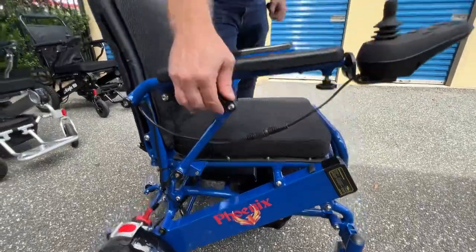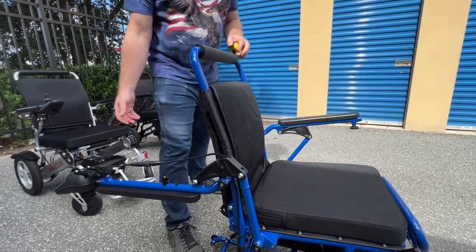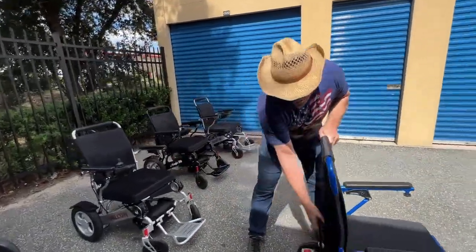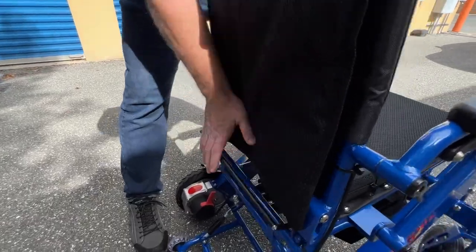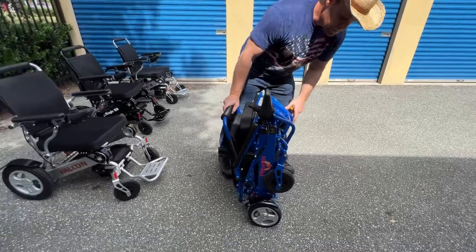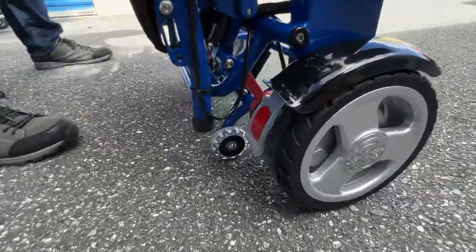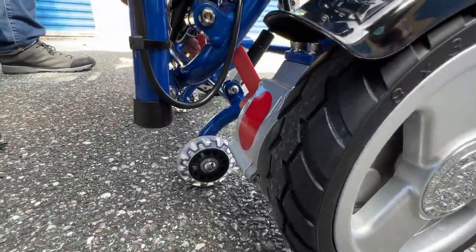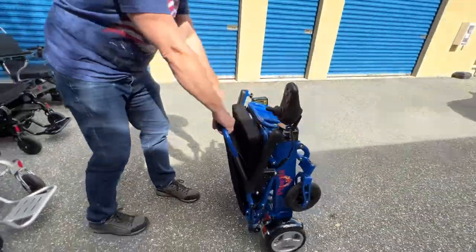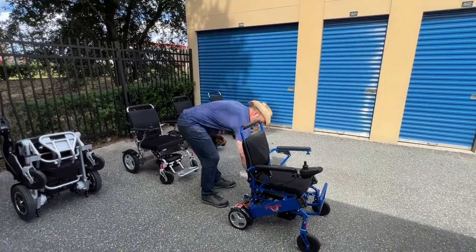The armrests on the Phoenix lift up and actually go totally behind the chair. Looking at the back, there's a very quick easy folding mechanism — one bar basically lets the chair unfold. You've got a kickstand wheel in the back, and if you put the chair into freewheel mode with those locks, you can push the chair very easily. The chair is very easy to unfold as well.